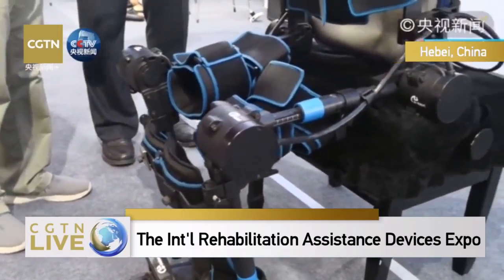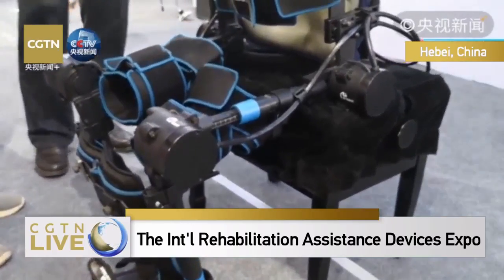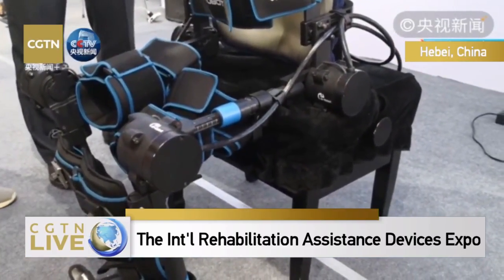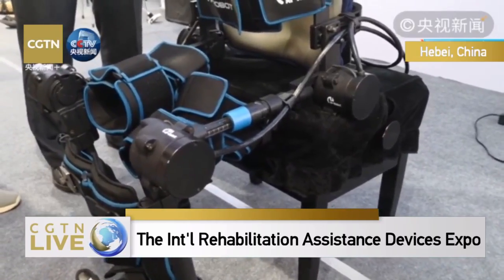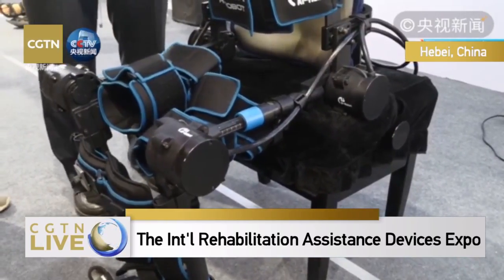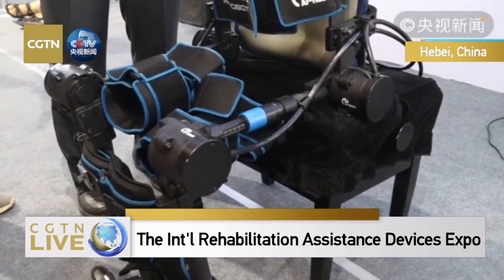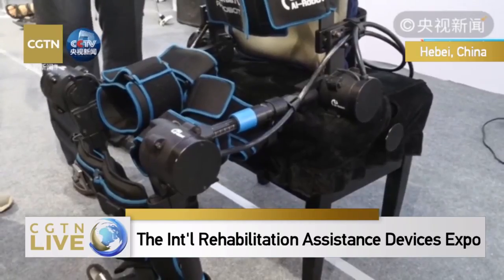So when someone puts this on, you still need the walking stick to keep balance. But you can rely on this for walking. The walking stick is only a preventive measure, just in case. But the major motive power will be from this robot.